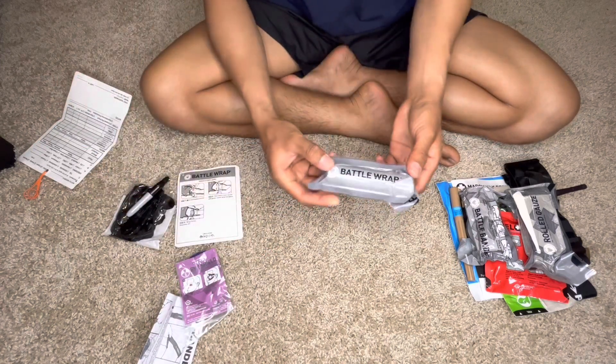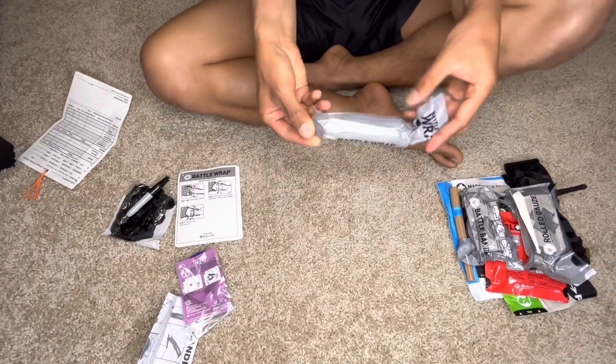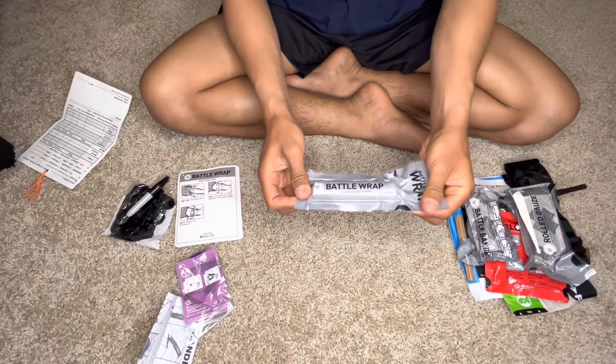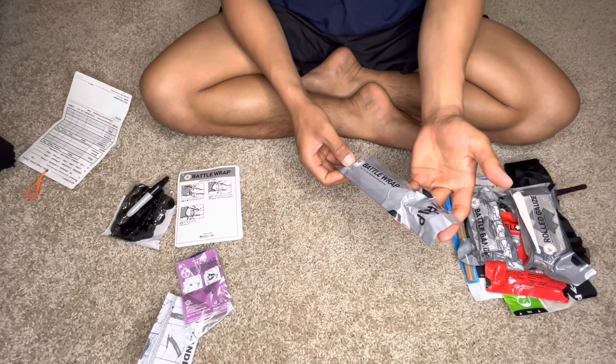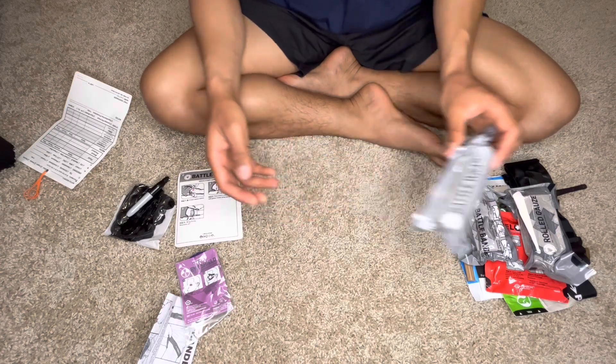Next one will be the battle wrap. This is the battle wrap. Same thing — still individually packed to prevent contamination.